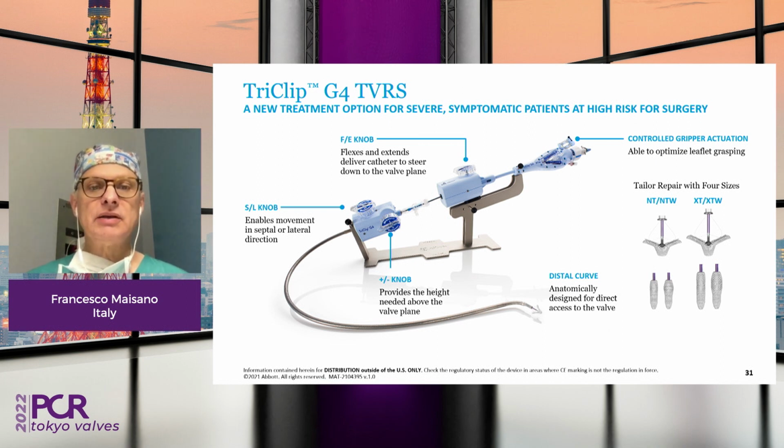This knob is basically bending the delivery system at the level of the inferior vena cava anteriorly, or let's say laterally, in the direction of the lateral wall, to allow a much better coaxiality. Lack of coaxiality overall is the main reason for failure in edge-to-edge repair, both in mitral and tricuspid.